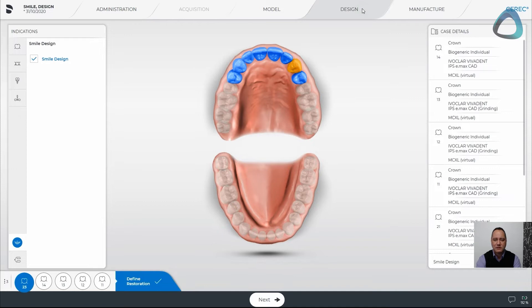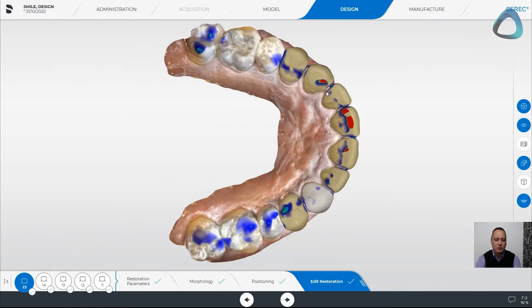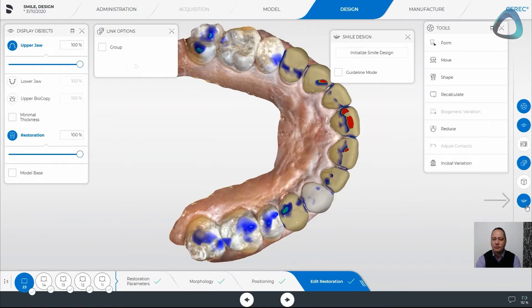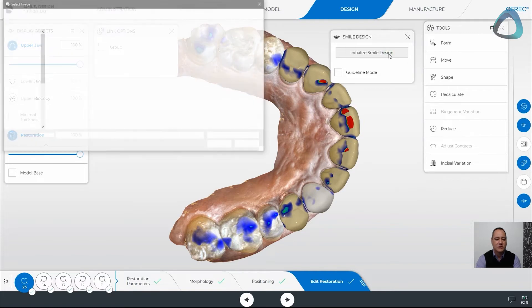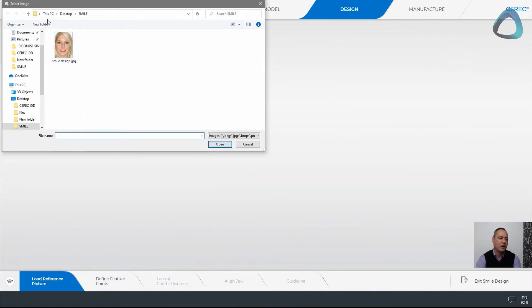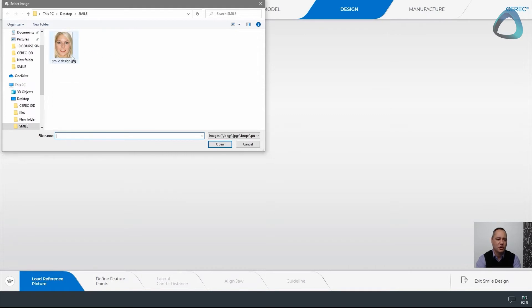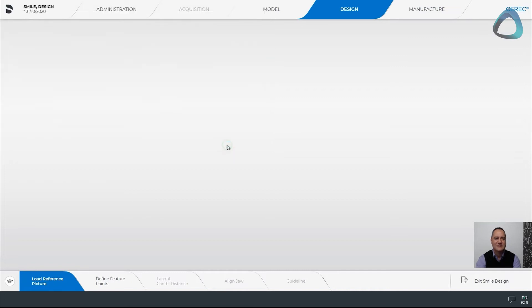If we jump back to design now, we will see this additional box with a little smiley face. This says 'initialize the design.' So we're going to initialize the design and find the file on the computer where we've saved this high-resolution face shot of the patient smiling, and open it.